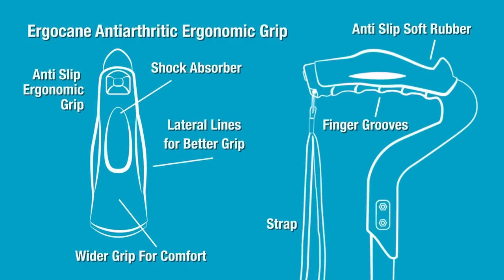The wider grip ensures that the user has full control of the Ergocane by making sure the strongest part of the hand — the palm — is fully clasped to the Ergocane. Other features include a bracelet that can be attached to the wrist, finger grooves, and a thumb holder for the best possible grip.